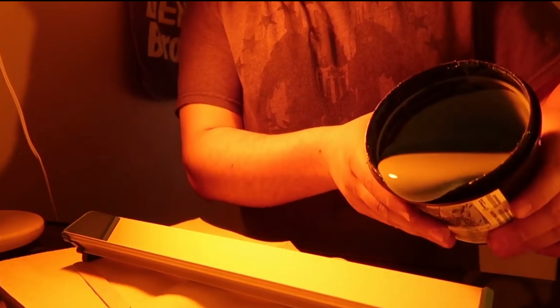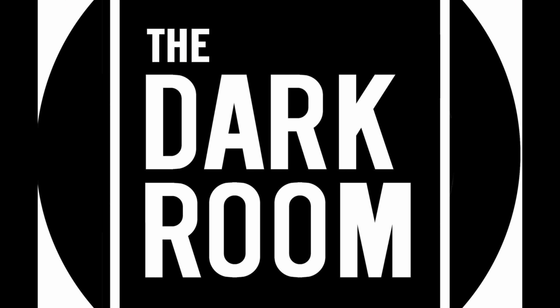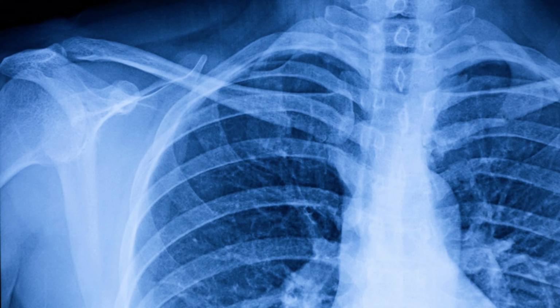Imagine operating in a room that is completely dark, but you have to execute your duties without any mistake. It is known as the darkroom, where X-ray films are processed.